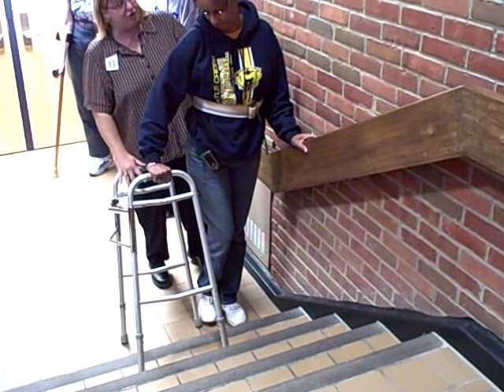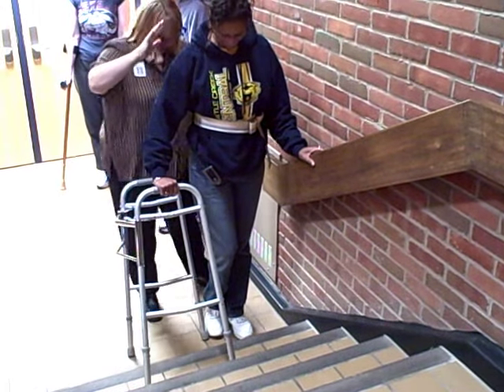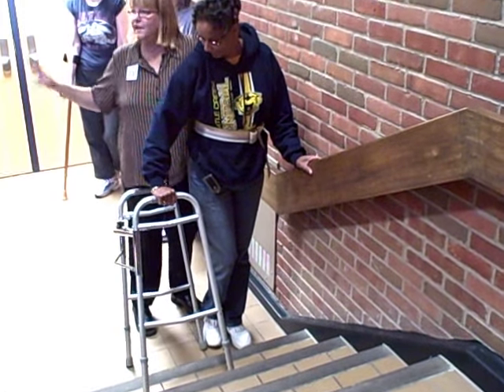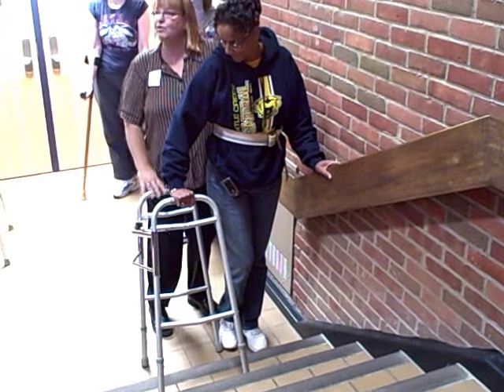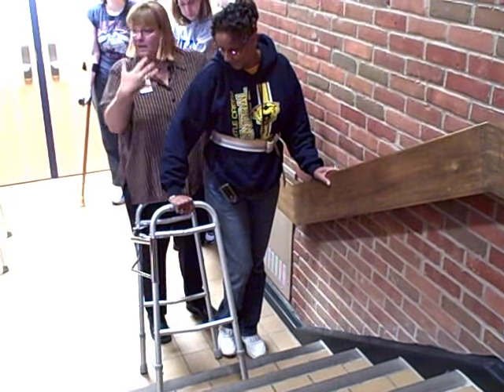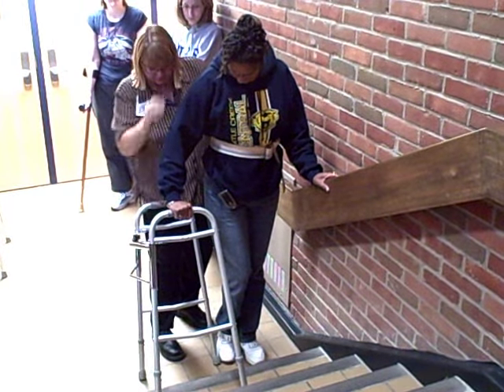Take this one and lift it up so that it's up on the stair — there you go. That's the position you're going to use. See how nice and sturdy that is when you put weight onto it? She is non-weight bearing on the right, so I need to stay toward this side. This is not easy to do, but try to get out of the way of this walker and stay kind of off to the side — but that's where you need to be.